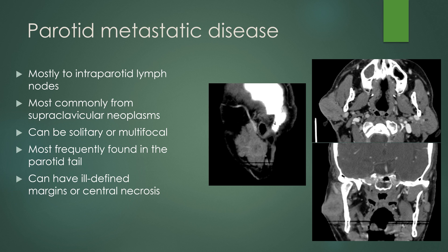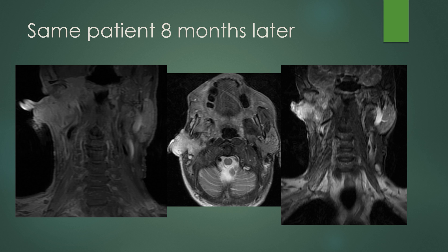Metastatic disease to the parotid gland is mostly to the intraparotid lymph nodes and most commonly from supraclavicular neoplasms such as cutaneous squamous cell carcinomas of the scalp. They can be solitary or multifocal, most frequently found in the parotid tail. Like other malignancies, they can have ill-defined margins and areas of central necrosis. Here you see this infiltrative mass within the parotid gland with central necrosis, no well-defined margins, and it is tenting the skin of the cheek with no clear separation from the dermis. The same patient eight months later on MRI shows this infiltrative mass filling the parotid gland with irregular enhancement and hyperintensity on T2.